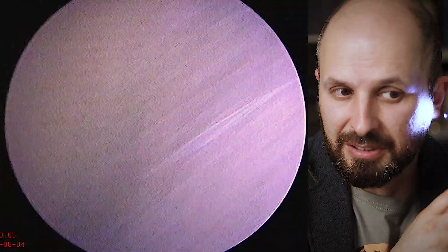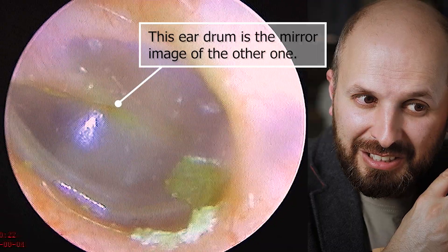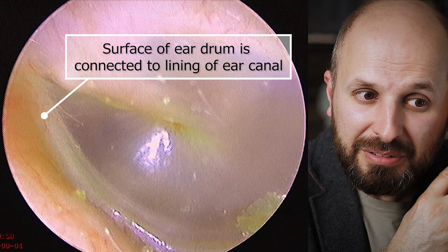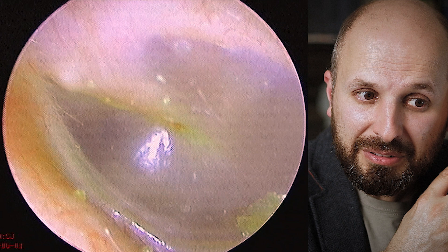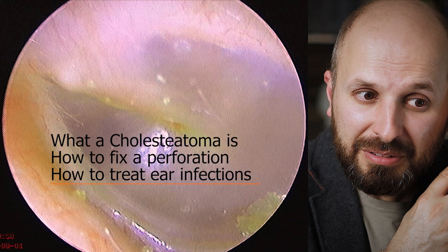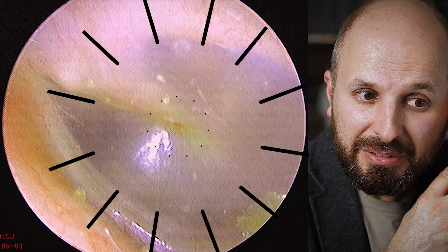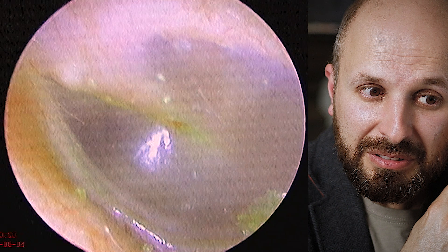I'll just take this out and show you the other ear as well. I'm very proud of my eardrum — it looks completely normal. If you look closer you'll see that the skin of the eardrum is actually the same as the skin of the ear canal. It's very important to appreciate this as it helps you understand what a cholesteatoma is and how to treat eardrum perforations and infections of this area. The surface of the eardrum actually grows out and becomes the skin of the ear canal, so these migrating cells create a transport system which slowly transfers wax and debris out of your ear.